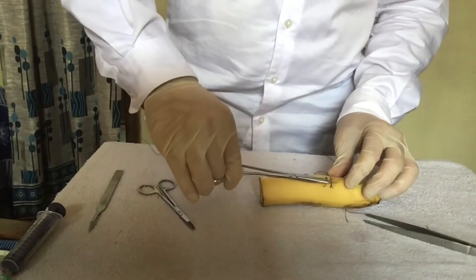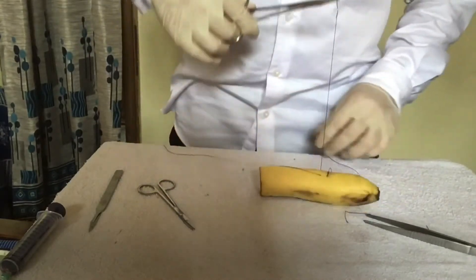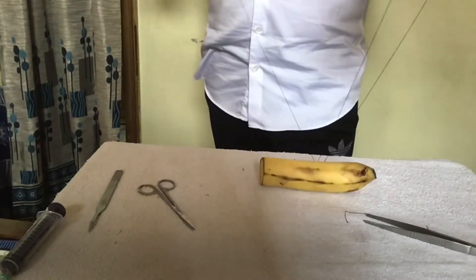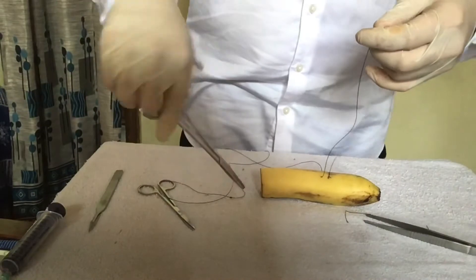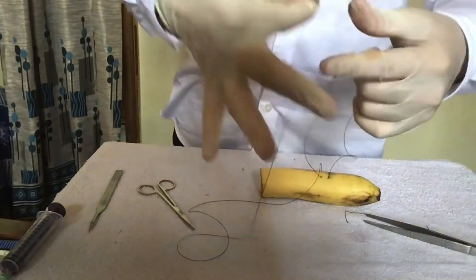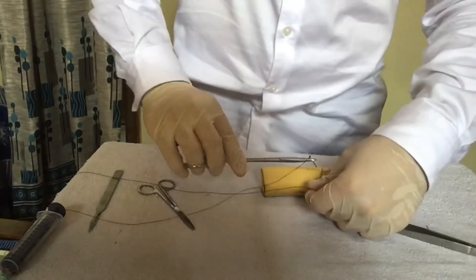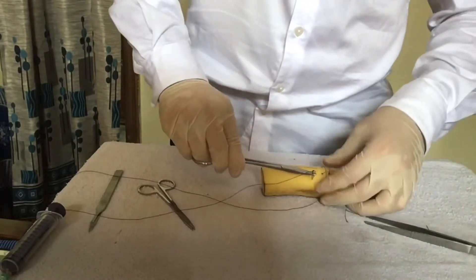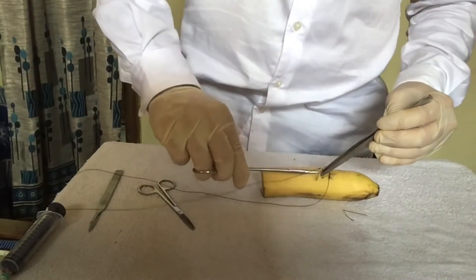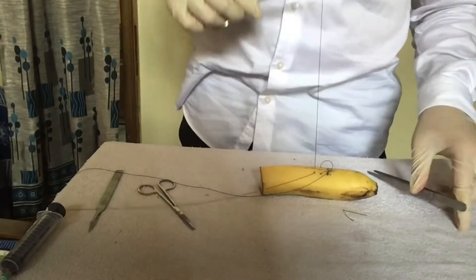For the second suture, when you pull out the suture, make sure you pass it through the loop formed between the first and second suture. Pass it through the loop, and now start doing your third suture — insert it 90 degrees perpendicular in the same fashion as done previously. It's better to take assistance from someone who can hold the loop tightly and pull it so the suture is tightly stitched.